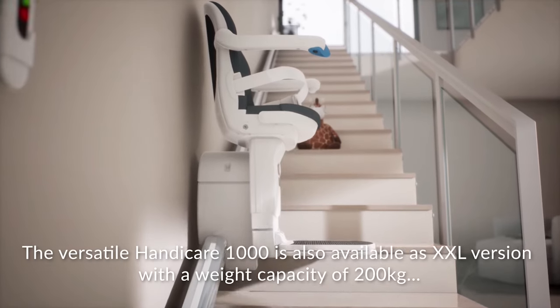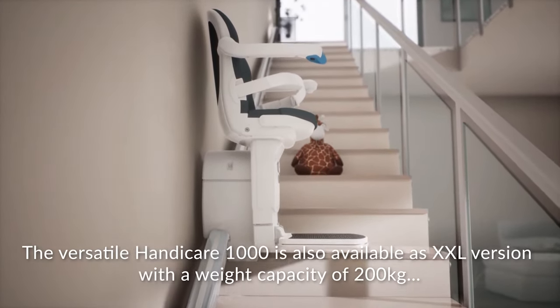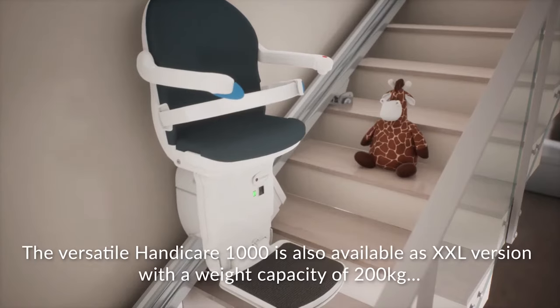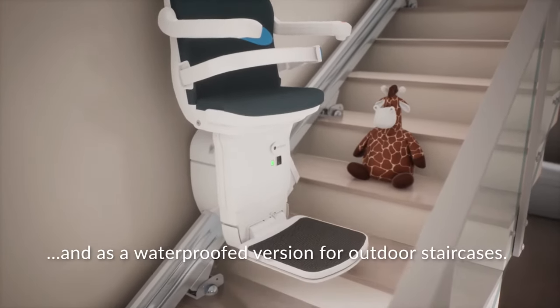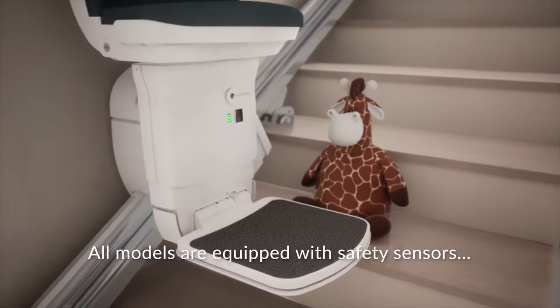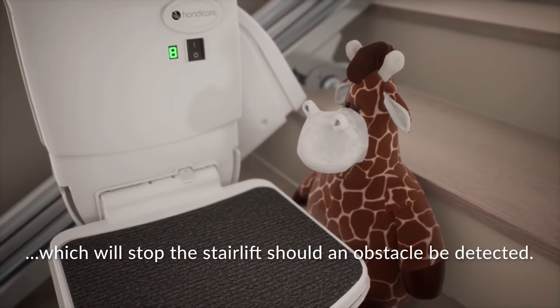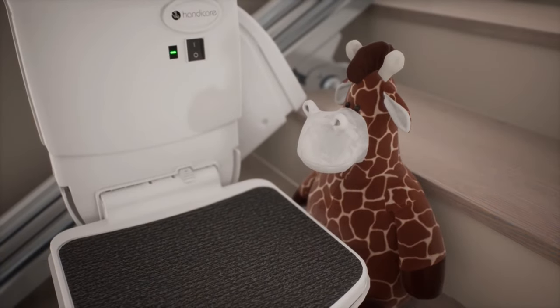The versatile HandyCare 1000 is also available as an XXL version with a weight capacity of 200kg, and as a waterproofed version for outdoor staircases. All models are equipped with safety sensors, which will stop the stair lift should an obstacle be detected.